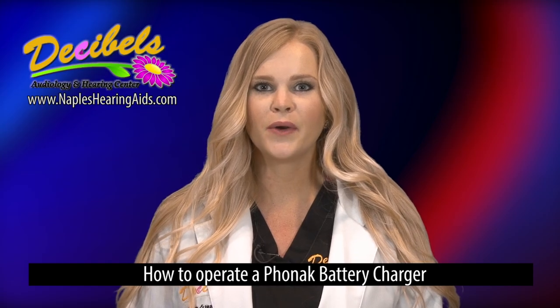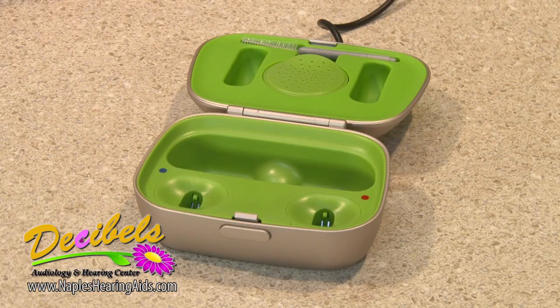This is how you operate a Phonak battery charger. First, you want to make sure that you plug your charger into the wall.